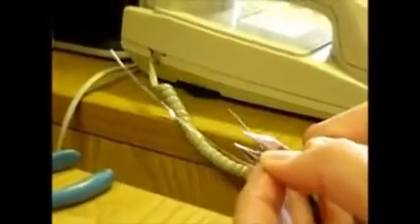The second order bend is now going to mess everything up. Now, second order bend, I would normally do like this. Again, keep it the right way up. You know which way the torque's working. So the roots are over here. This is up on your upper wire. So these are the roots. So this is the gingival side.